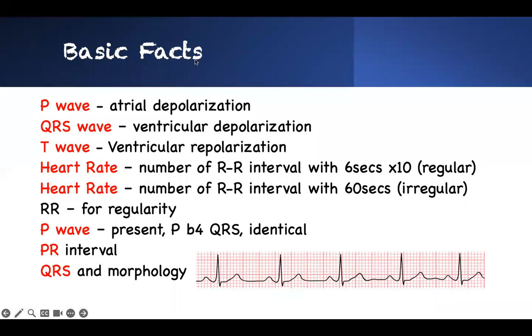Before that, we have to know certain basics, very short information about EKG. The EKG is basically designed to look at the functioning of your heart. The heart has the atrium and the ventricular portion, and each segment gives an electrical signal through conduction. We don't have to go into details. This is your P wave, and this is your Q, your R and S wave, and this is your T. And you keep on continuing back and forth. The atrium depolarizes and then repolarizes. Then the ventricle will depolarize and then repolarize.